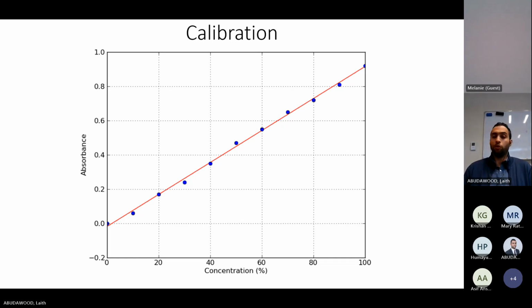But of course, you don't report optical density. You report D-dimer in micrograms per ml or whatever it is. Fibrinogen is a clotting assay, but I report it as milligrams per deciliter, which is concentration. So the calibration allows me to convert seconds into milligrams per deciliter.